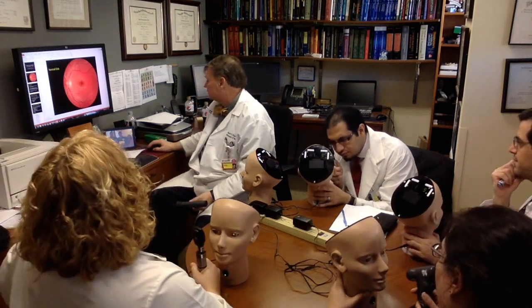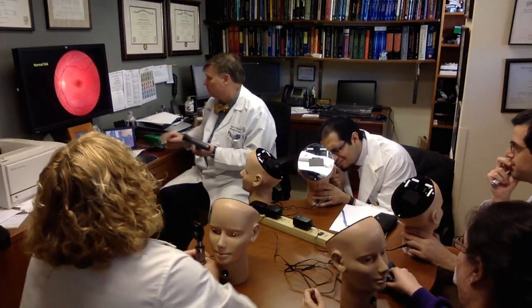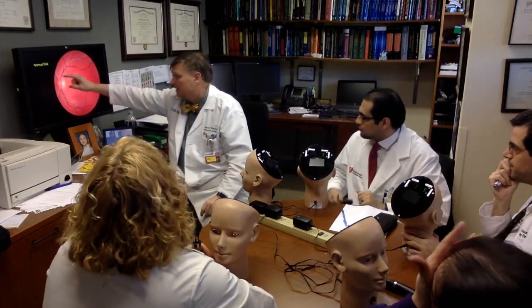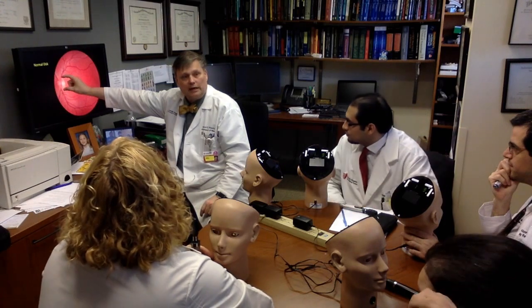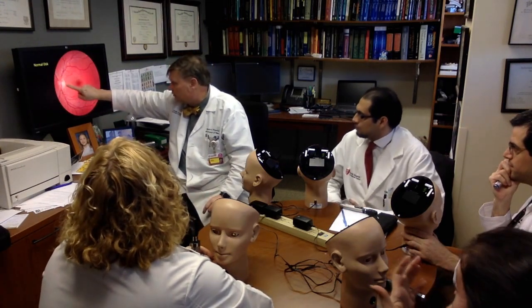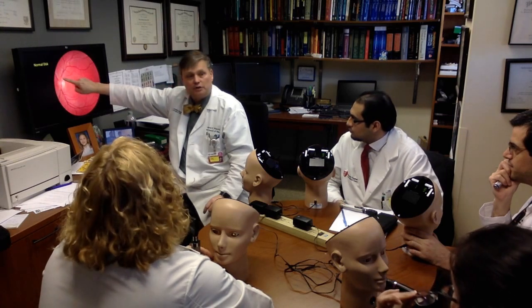So let's take a look at this here. All right, this is what you just saw a moment ago. Again, here's our disc, which is circular, but actually slightly oval, a little bit higher than it is wide. The margins are very sharp.